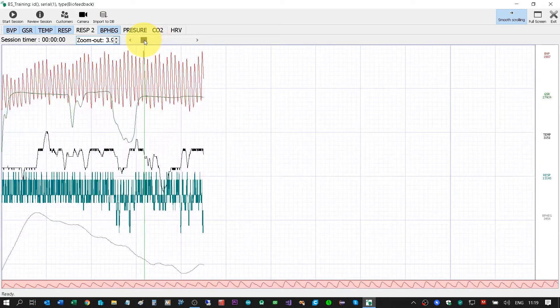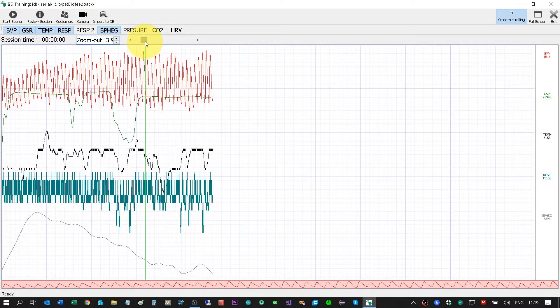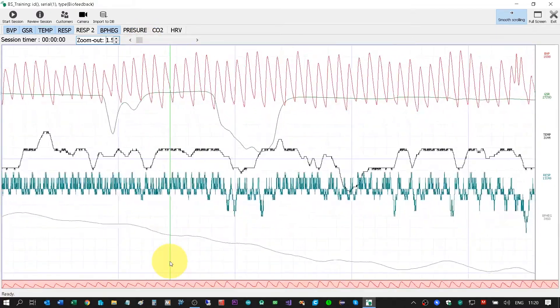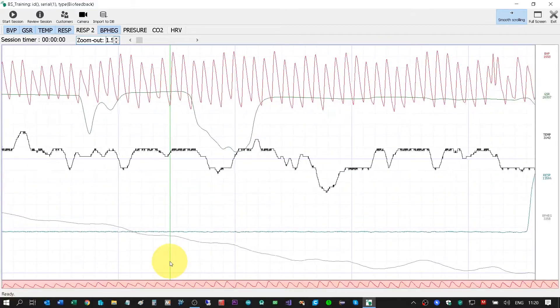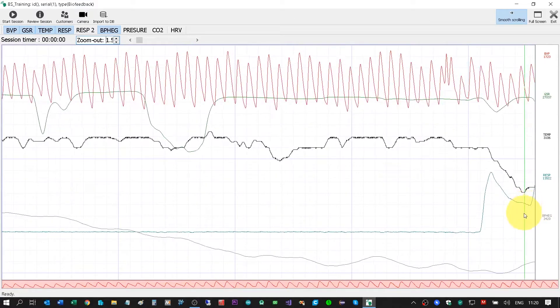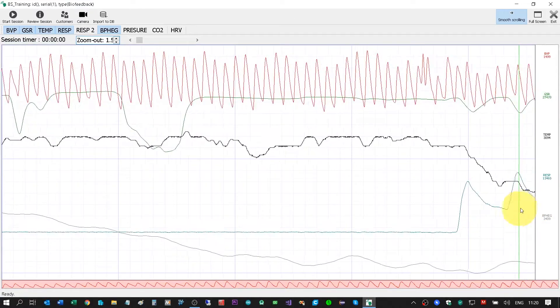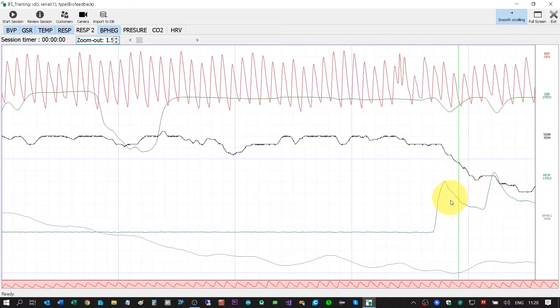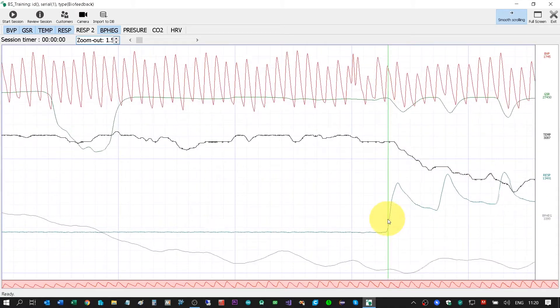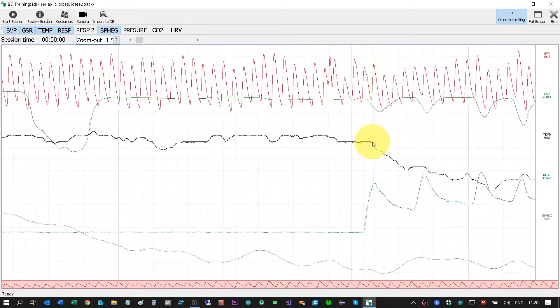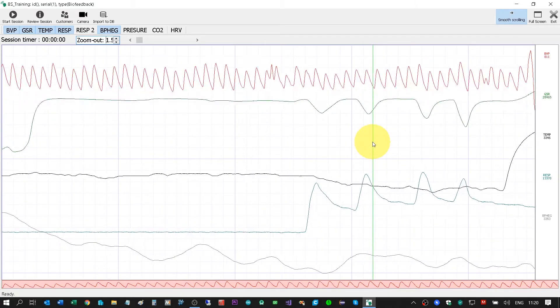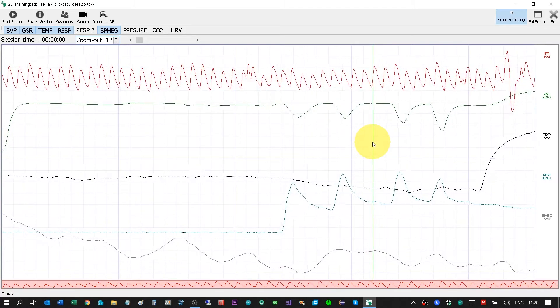I can check the quality of the signals before doing any kind of training. For example, right now I will move the breathing belt — as you can see, this signal is from the breathing belt. Now I will check the temperature — the black line. I will touch the sensor and you can see how the temperature goes up.